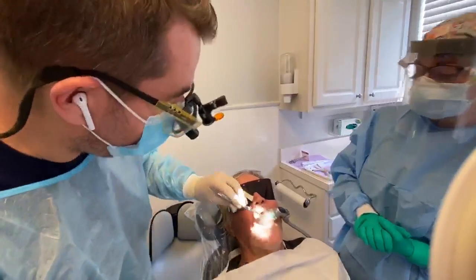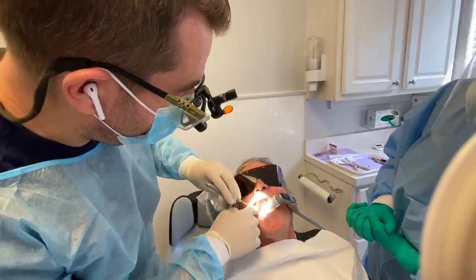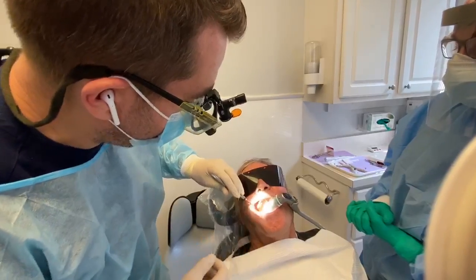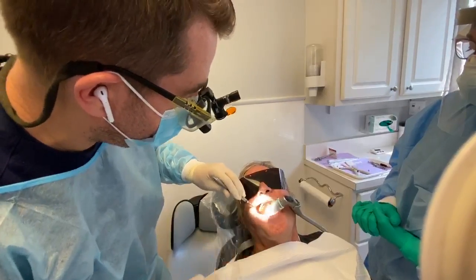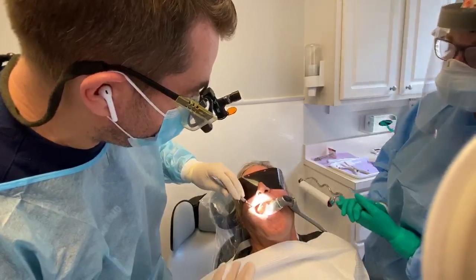The Isolite will let your patient stay open, prevent anything from dropping, and isolate the area. I'm using my headlight, so this time I don't need the Isolite light. And let's turn on the suction for my awesome assistant — it's suction for you.